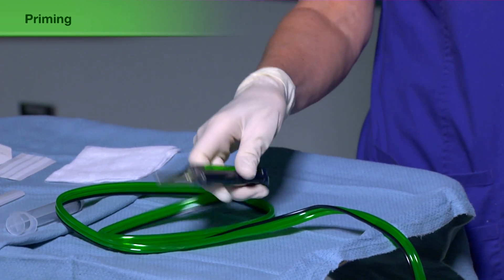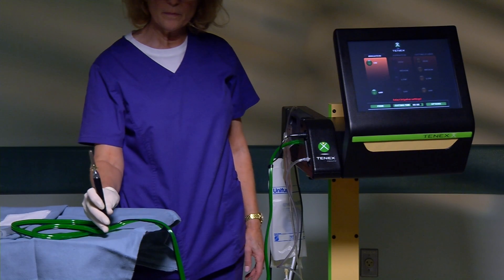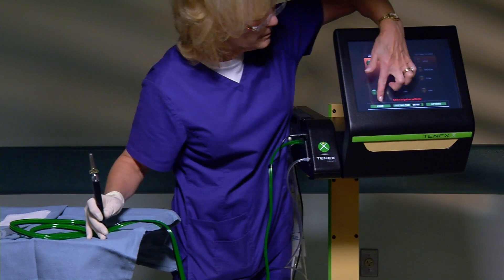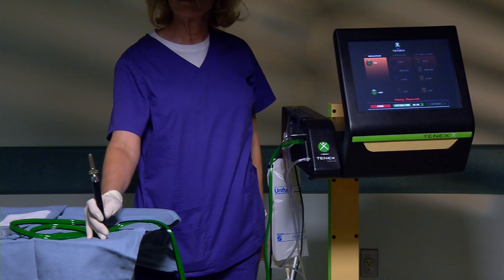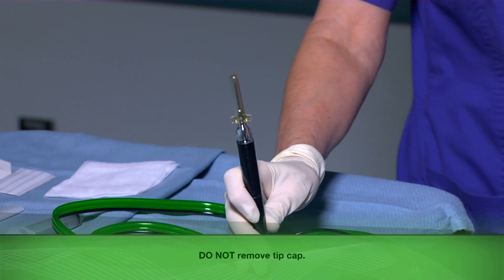To prime the system, begin by putting on one sterile glove. With the tip cap on, hold the TX micro-tip handpiece in a vertical position with the needle pointing upward. Select the prime key on the TX console. A successful priming cycle will be indicated by the message: priming successful. After successful priming, leave the tip cap on.